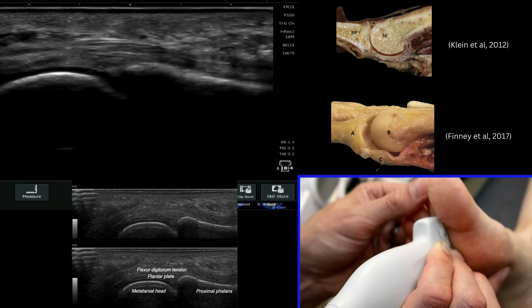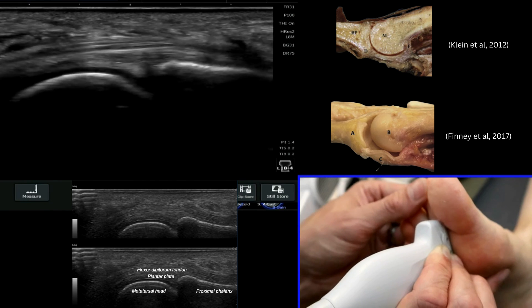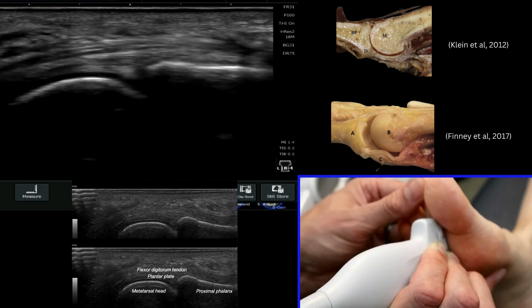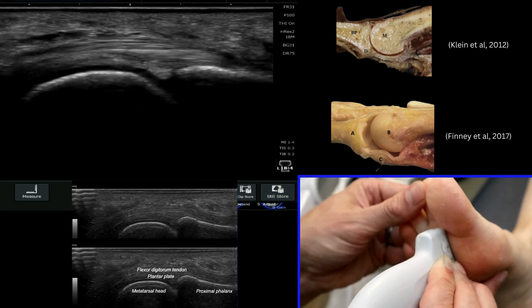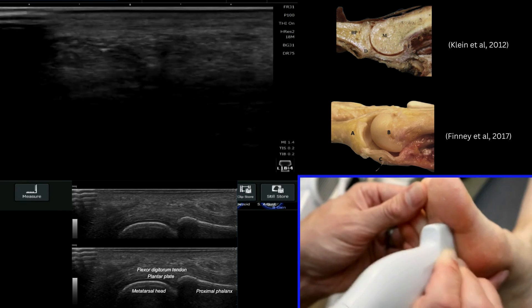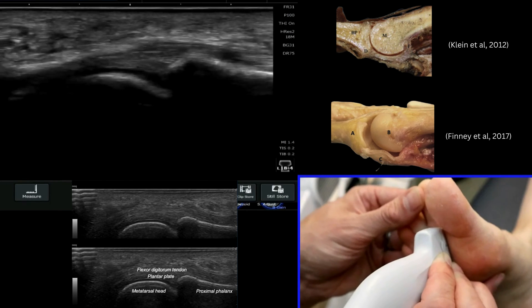I can also dorsiflex or place an anterior shear stress test on this plantar plate whilst sonographically looking at it. I'm pushing down on the metatarsal here to stress the plantar plate, and I can say that it's all nice and uniform. The thickness is uniform and the insertion looks normal. It's important to have a good look all the way through the lateral and medial aspects of the plantar plate.